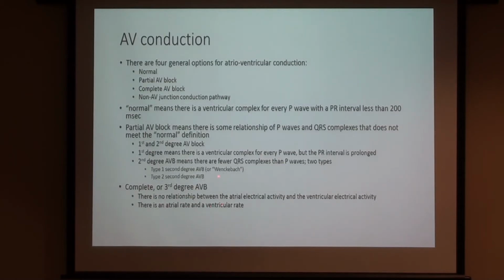Okay. There's an atrial rate and a ventricular rate, and you should report it as such. There could be normal sinus rhythm, third-degree AV block, ventricular escape rhythm at a rate of whatever, and it's usually slow. Remember that every cell in the heart has a potential to be the pacemaker. The typical ventricular escape rate is about 40, 45 maybe. The junctional escape rate is usually about 50 to 60, and obviously the normal sinus rate is somewhere usually between 70 and 80 or so.